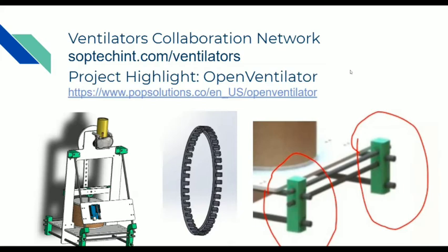It's very easily found. And on the electronics, mostly these sensors, some end switches, and an ultrasonic sensor is what we need for making a ventilator.